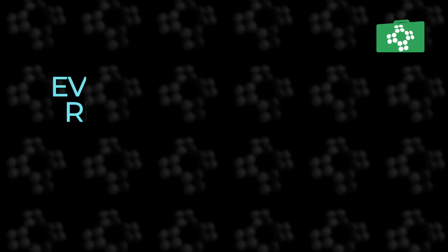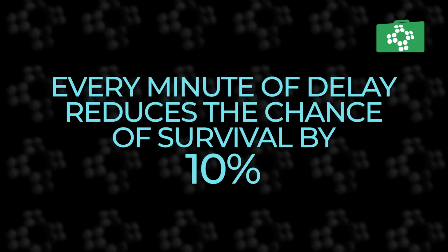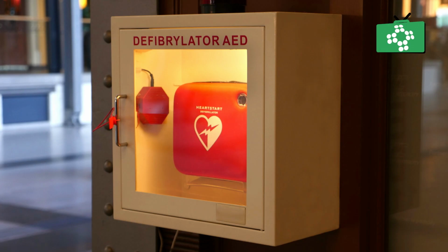The hope is that this AED unit would arrive on scene before the emergency services. It could save valuable time. Remember, every minute of delay in the AED being deployed gives a drop of 10% in the survival rate. If we could get there 2 or 3 minutes earlier than the paramedics arrive, the person's chance of survival is much higher. Community AED units are usually maintained by the community or local businesses.